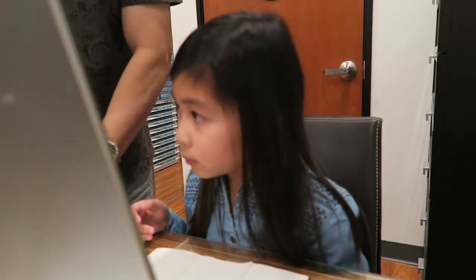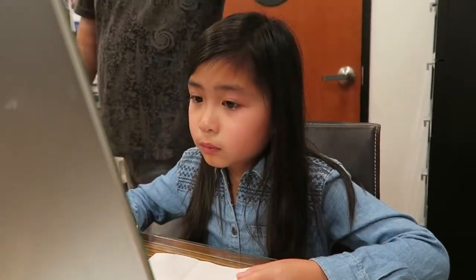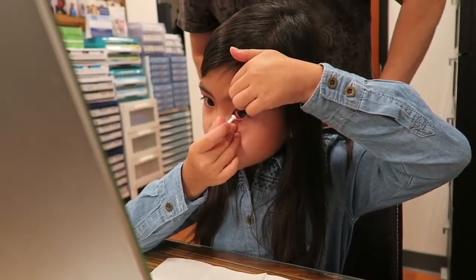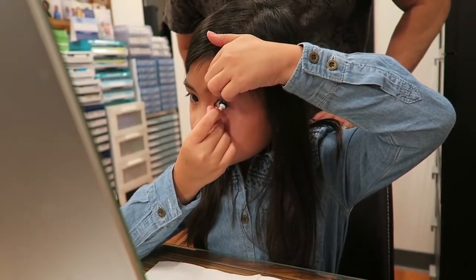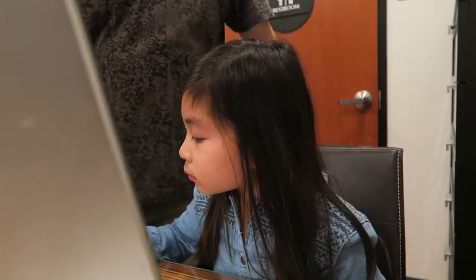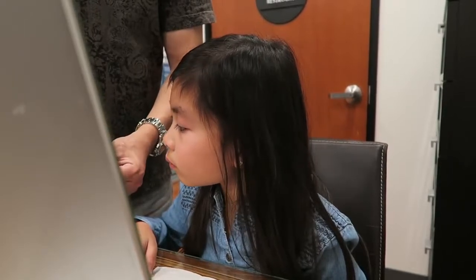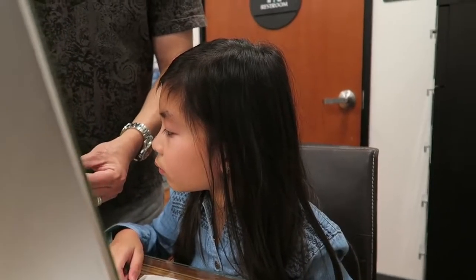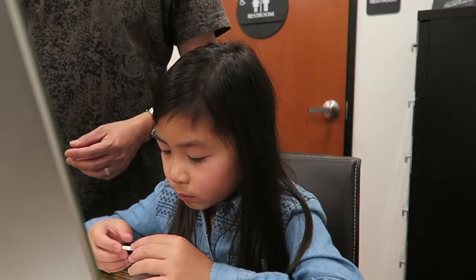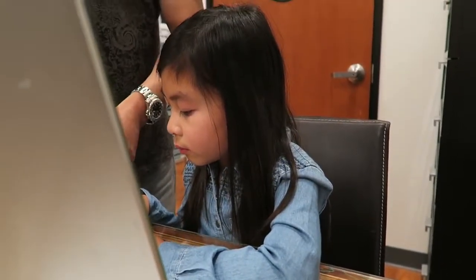We're gonna do the same thing with your left lens. Same thing: left hand, pull up your upper eyelashes, pull up, pull down, look straight, press it, harder — take it out. When you take the lens out, you see this big suction here. Sometimes when you take them up it's right in the center like that. You don't want to pull the lens straight out — twist it and break the suction, okay? If you pull it straight out it might break in half. Hold on to the edges, twist it to the side, just break the suction. Good! Wonderful!